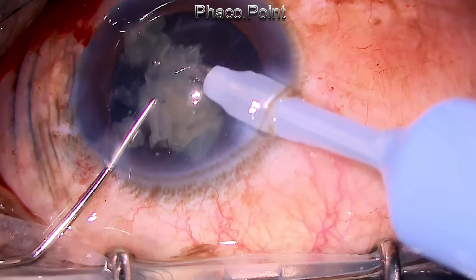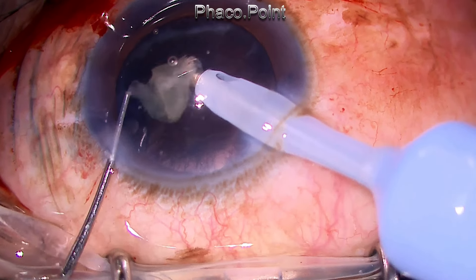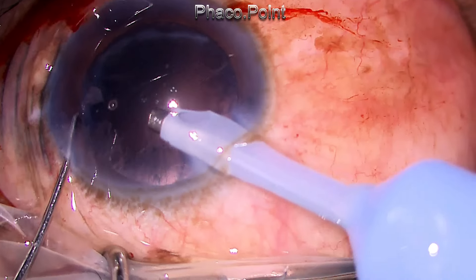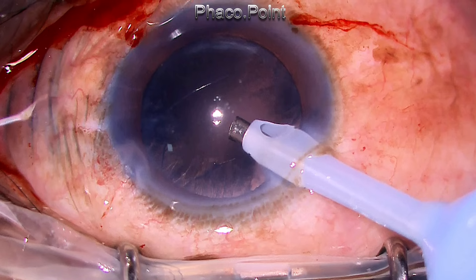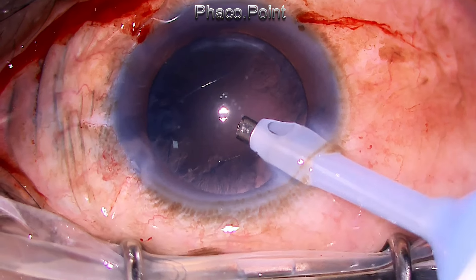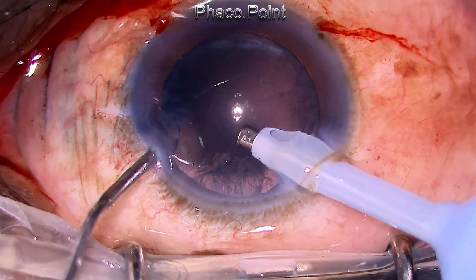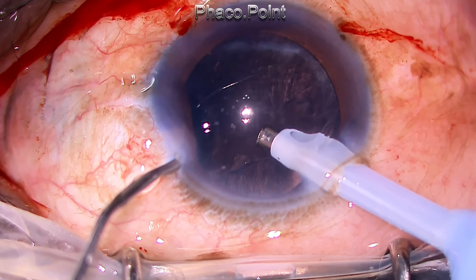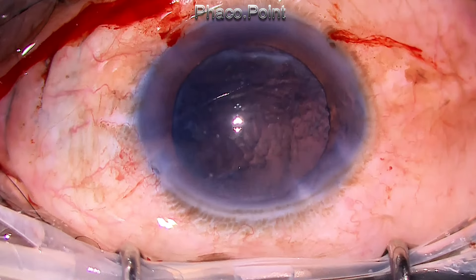What I learnt about intumescent cataracts is that there are two major types: one with liquefied cortex, which with sufficient precaution allows you to get away with a double rhexis or any technique. But the real stinkers are those which have solidified swollen cortex — these are absolutely very difficult to achieve a controlled capsular rhexis. Also, when exiting the eye, do not forget to perform a viscofluid exchange.